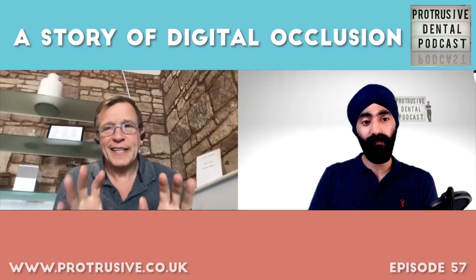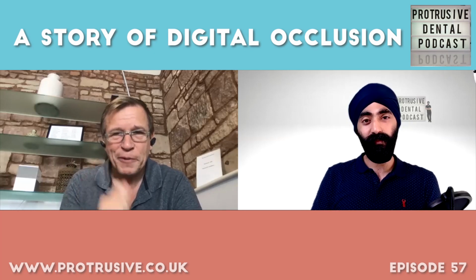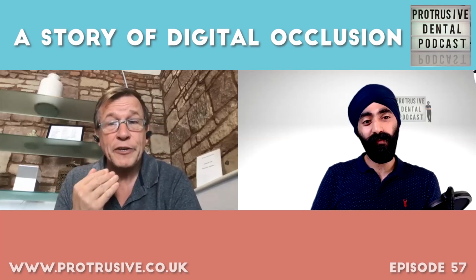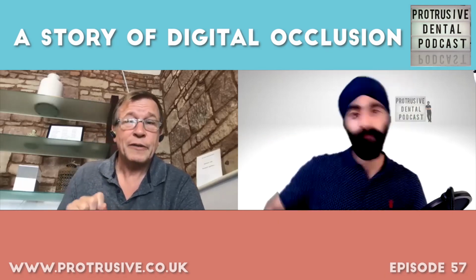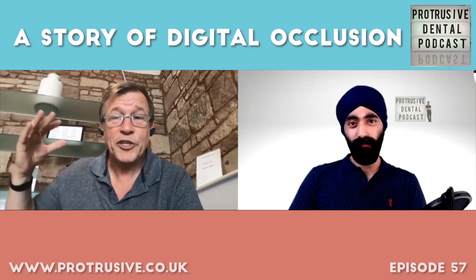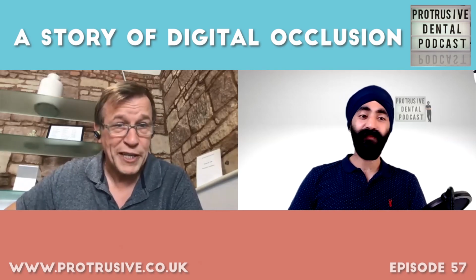So this is where there's a really important part, Jess. Let me try and explain this. There's a difference between what we might call an incisal-facial mock-up, just to show people the way it is, which, sitting on my high chair judging everyone, I would look down upon, because where's the function in this?